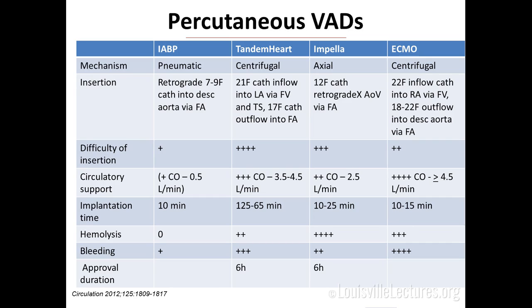In terms of what it actually provides, I put in parentheses here cardiac output because it doesn't actually provide cardiac output. You may see an increase, and we'll go through that mechanism, but in and of itself, the balloon pump is not actually providing direct cardiac output, so don't let anyone tell you that it is. They're lying if they say that. It's easy and quick to put in. You don't get hemolysis. You don't get much bleeding. It's literally just an arterial cannula in the artery. The same way if you accidentally put a cordis into an artery, it's pretty much the same size as this.